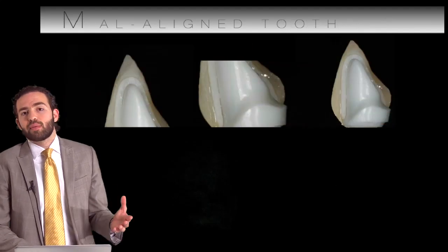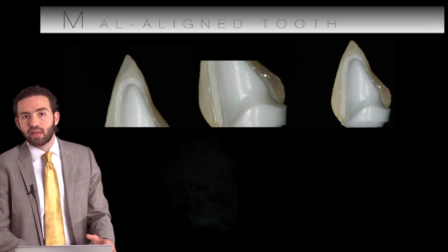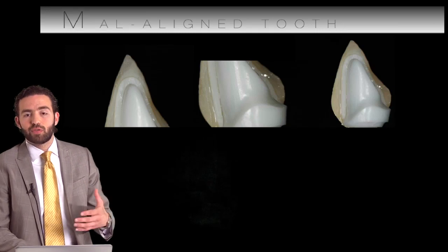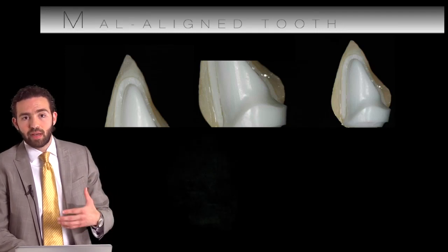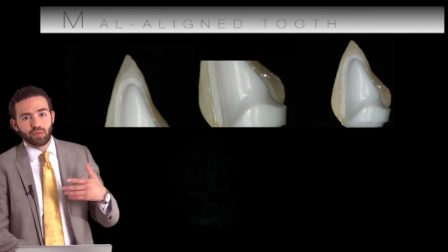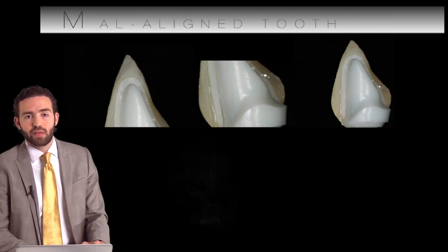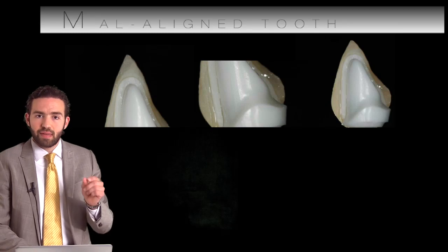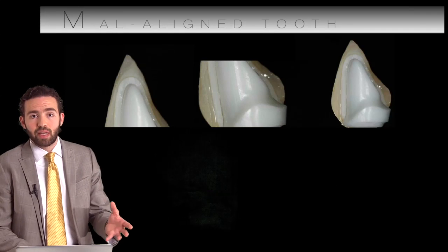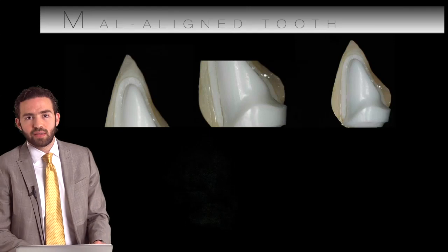Again, we've got an issue sometimes where we have a malaligned tooth, where the tooth is a bit more on the buccal side, and you want to be more on the conservative side, and you don't want to prepare more because you might have an issue of pulp exposure, and then going into the root canal treatment and maybe a possible post and so on and so forth. So using a thin zirconia coping and matching it to the adjacent tooth, which also can be a high value, zirconia restorations are really useful in these instances.